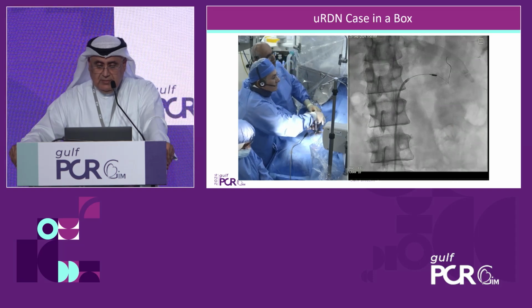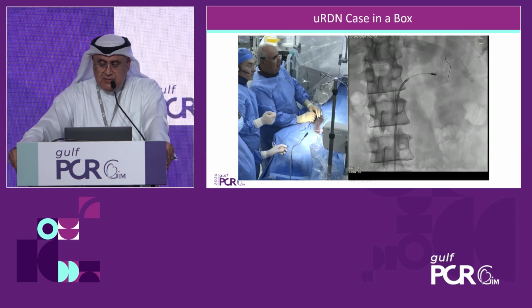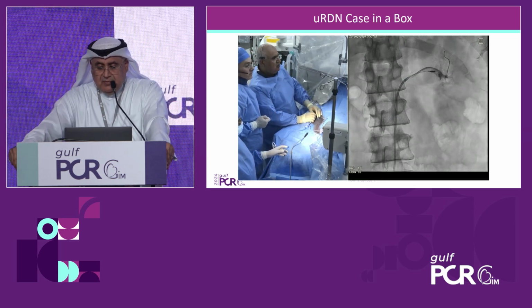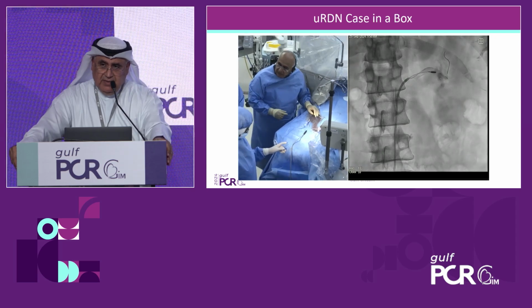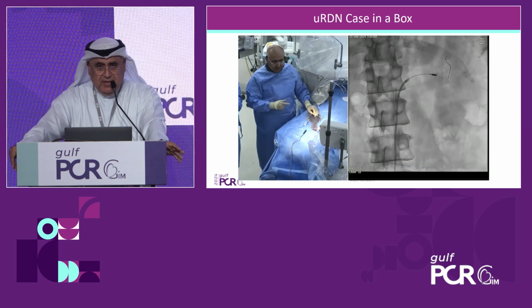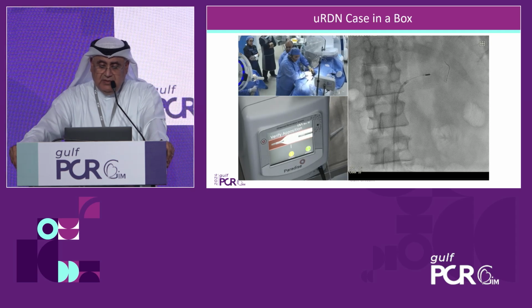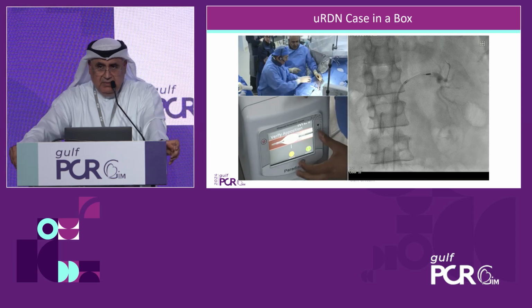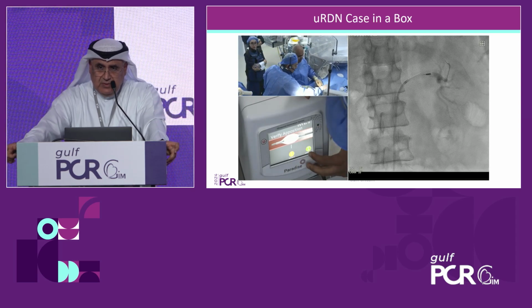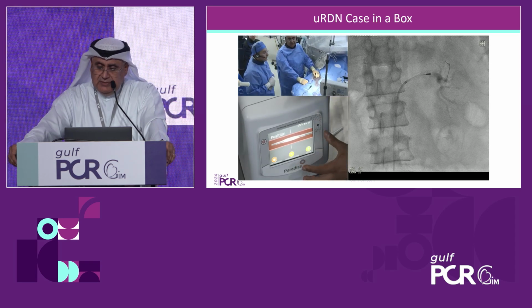This looks okay to me. Position just 5 millimeter to 1 centimeter from the distal parenchyma. So the transducer is sitting nicely in this. You have to move, maybe find yourself a good projection where you could really identify the landing zone. We can give 2 to 3 or 1 to 3 ablations per each renal artery according to the length and the distance. Bearing in mind, we have to leave something like 5 millimeter, which is the width of the transducer marker between each ablation or energy delivery.